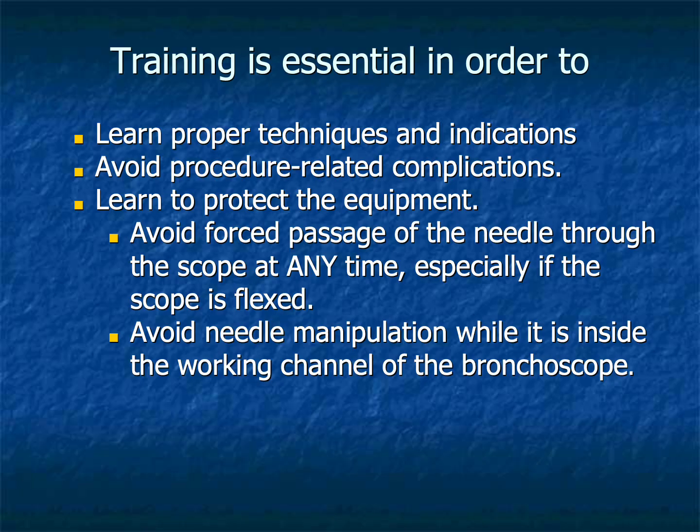It also teaches operators how to protect the bronchoscope, avoid unnecessary damage to the working channel, and prevent potentially serious complications. One of the most important practical principles is never to force the needle through a flexed bronchoscope or manipulate the needle while it remains inside the working channel. Protecting the equipment is an important component of procedural competency.